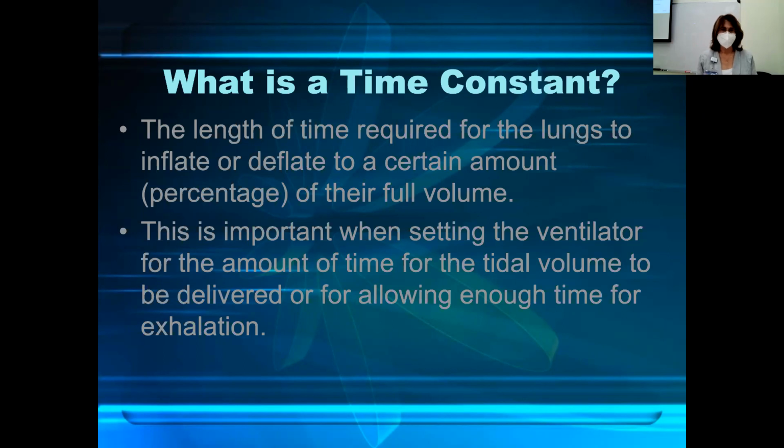So a time constant, let me explain a time constant. The bullet says it's the length of time required for the lungs to inflate or deflate to a certain amount or percentage of their full volume. The length of time required for the lungs to inflate. So when you're pushing a volume of air into the lungs, the amount of time it takes for the lungs to be completely filled up, it's called a time constant.